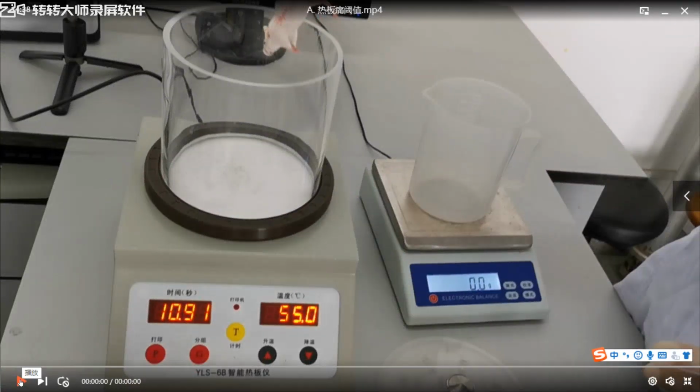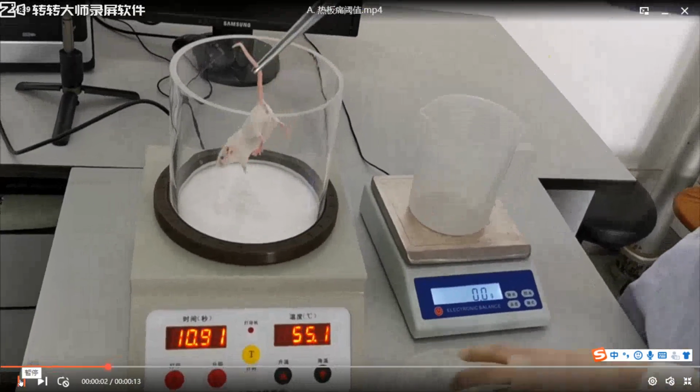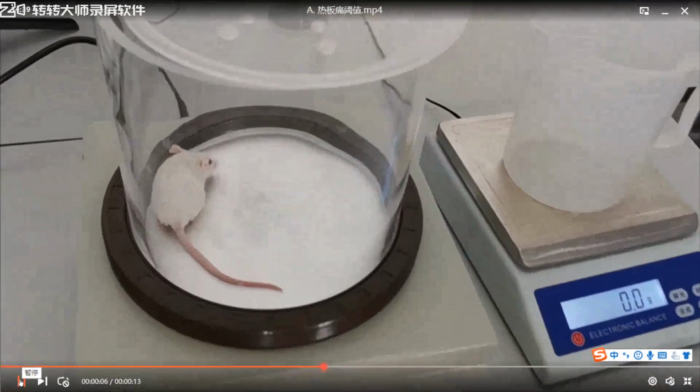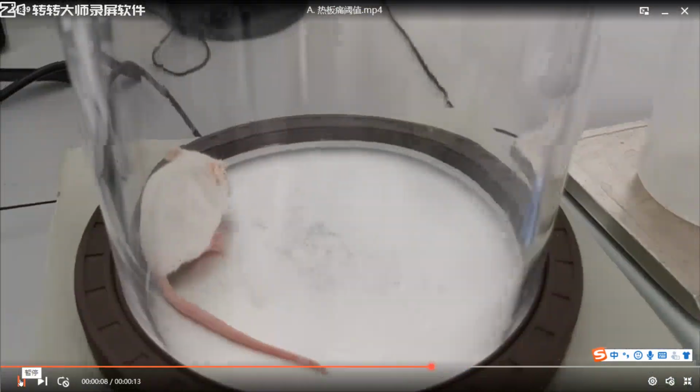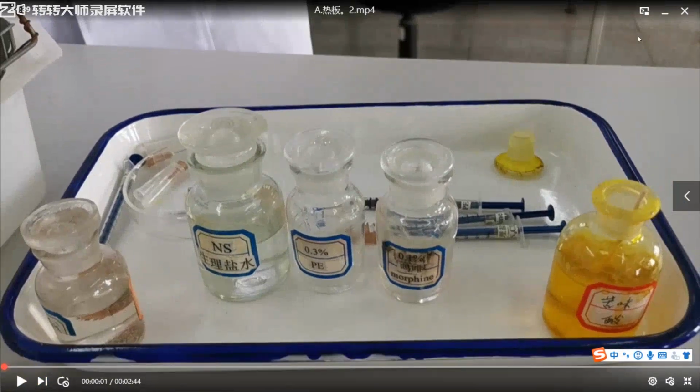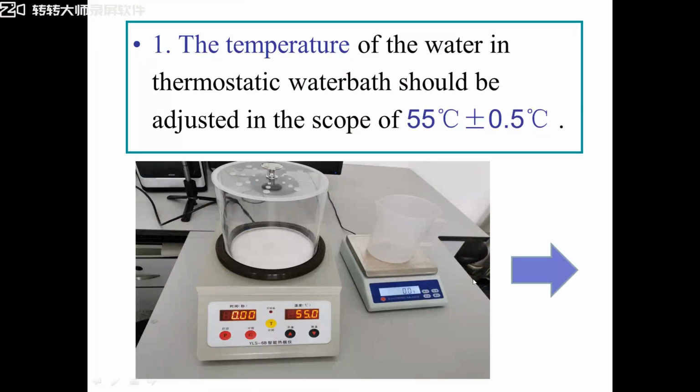Okay, put the second mouse onto the hot plate and test its pain threshold. Just now the mouse licked its hind claw. So write down the pain threshold of each mouse.